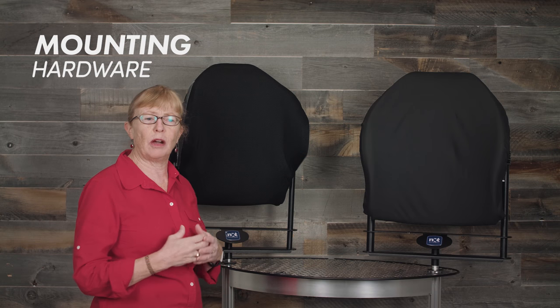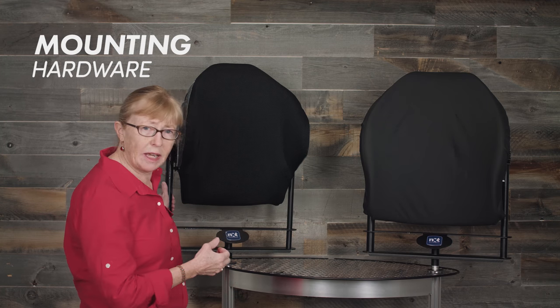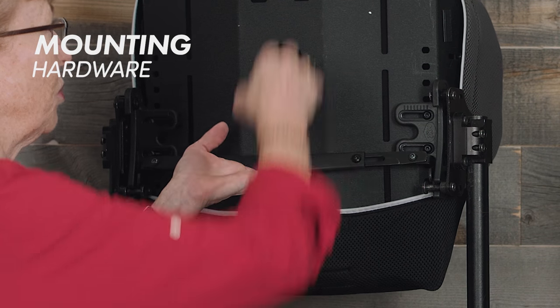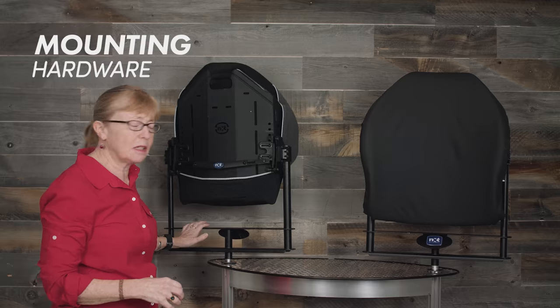An important feature of any back support is how it is removed and put back onto the chair. Often, particularly with folding manual chairs, people do not get a rigid back because the effort to take it on and off is quite challenging. With the next series we have what's called a one-handed release — I just need to lift, push forward, and off the back comes off the wheelchair, and then I can snap it back on very easily.